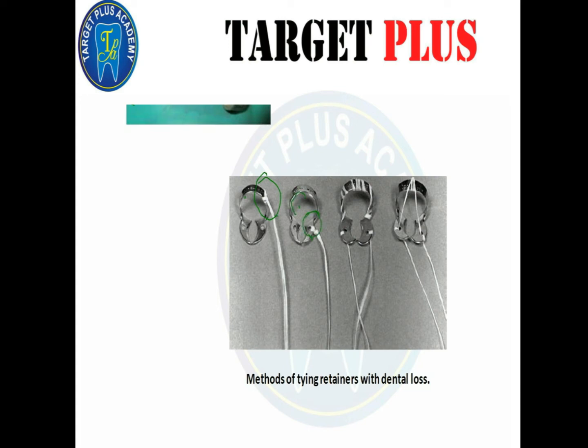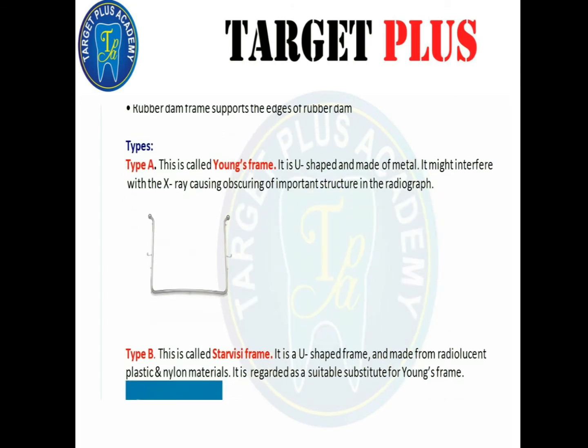Now next we are going to discuss the rubber dam frame. Now rubber dam frame supports the edge of the rubber dam. Now various types of rubber dam frame, let us discuss them.